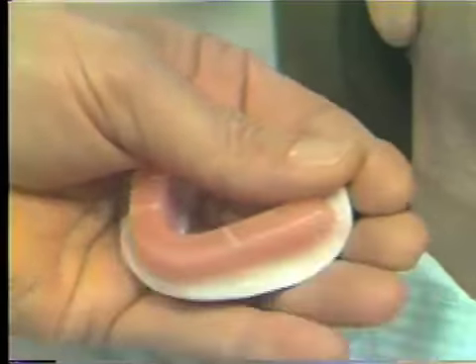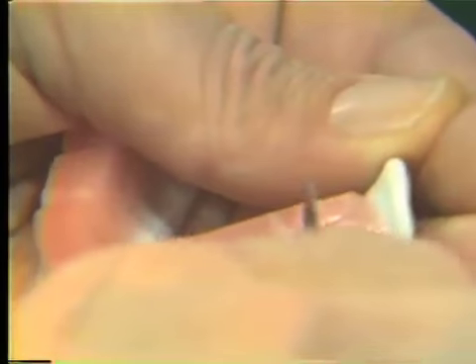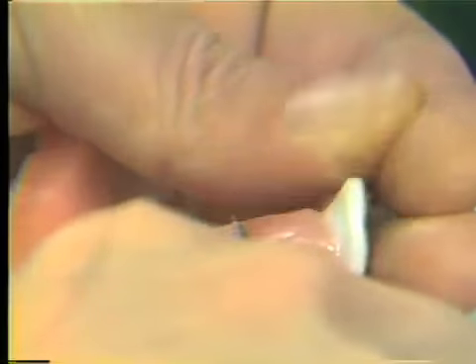Then we'll use a lubricant, and for that purpose we'll use Vaseline to wipe over the lower wax occlusion rim. This will allow easy separation in the mouth.